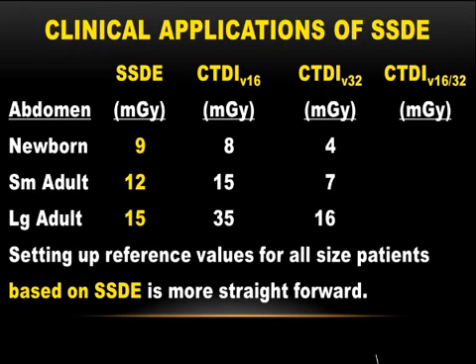And if I have, again, a combination, it again doesn't make a lot of sense: 8, 15, and 16. And back here at the 16 centimeter CTDI phantom, I could maybe see some pushback from a clinical person saying, I don't want to give 35 milligray of dose to a patient from an abdomen, and none of us do. Obviously, it's really 15 milligray, not 35.